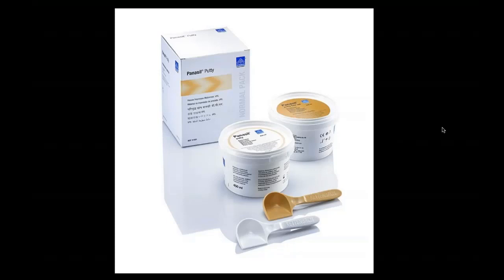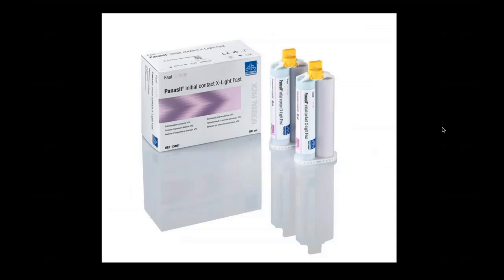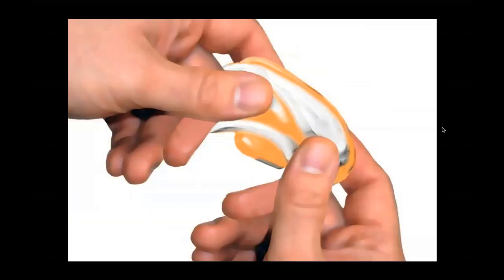Okay, so we first of all mix the putty. This is what the putty looks like. It's Panasil putty. It sets in about 2.5 to 3 minutes. You'll mix the base and catalyst, place it in the tray, and then place it in the patient's mouth.